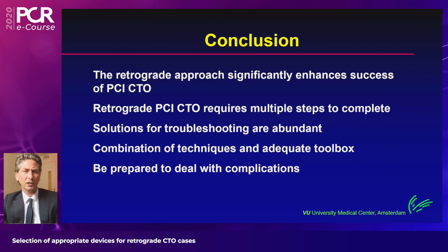So in conclusion, I'd like to state that the retrograde approach significantly enhances the success rate of PCI of the CTO, and that multiple steps are needed.